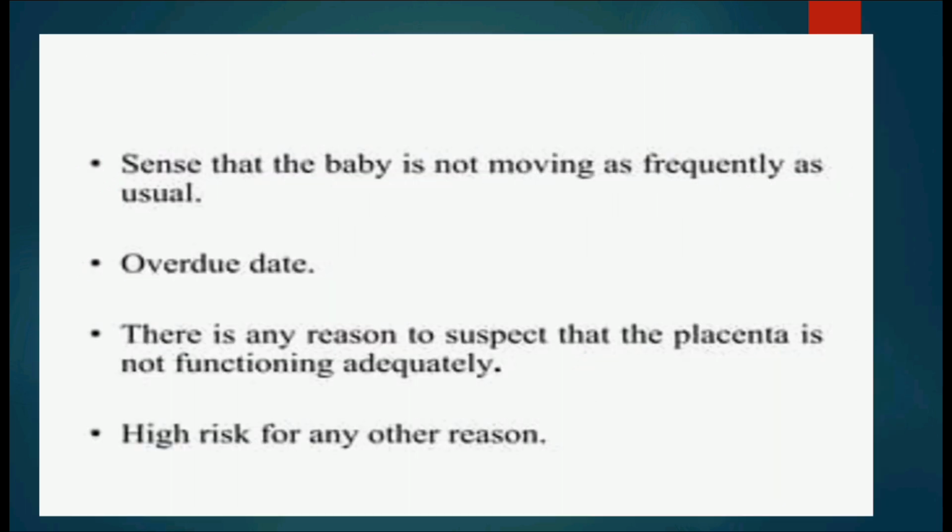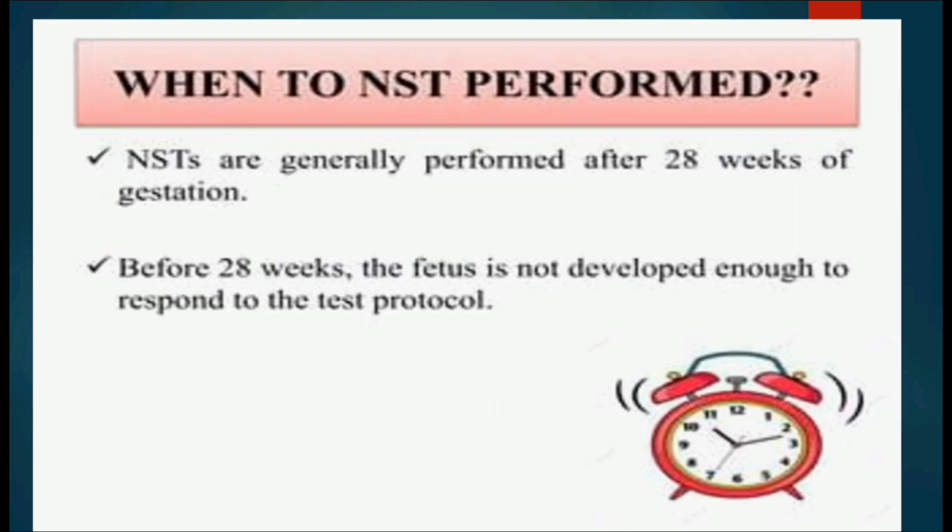Or if a baby is not moving as frequently as usual, or the pregnancy is over the due date, if there is any reason to suspect that the placenta is not functioning adequately, or any high risk for any other reasons, we do NST.